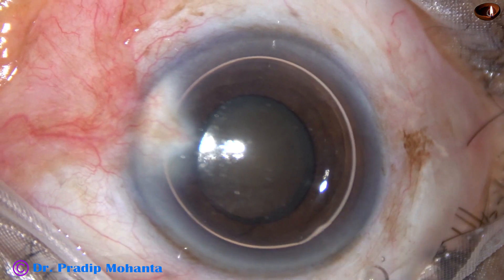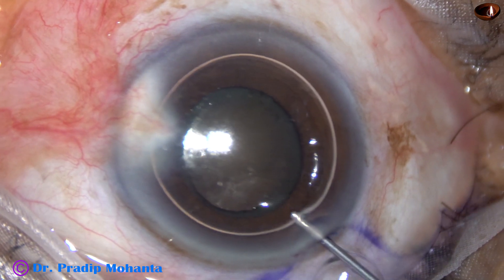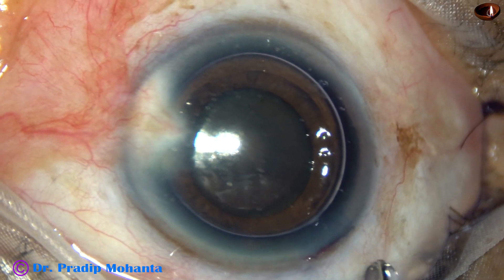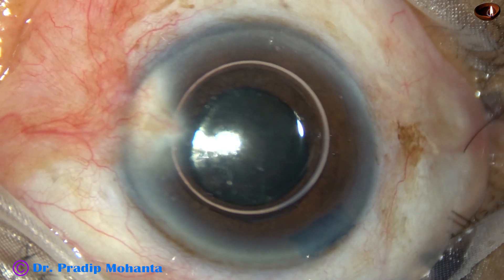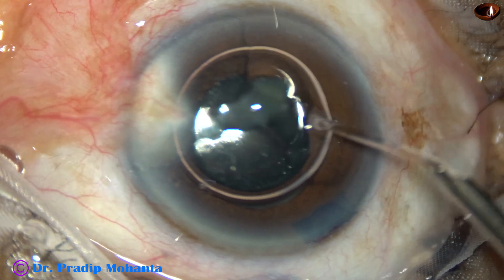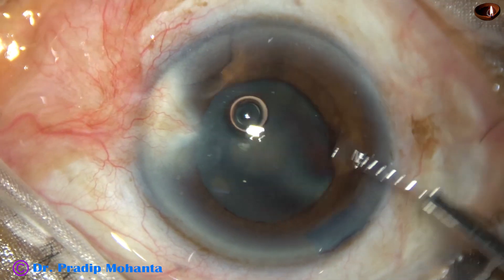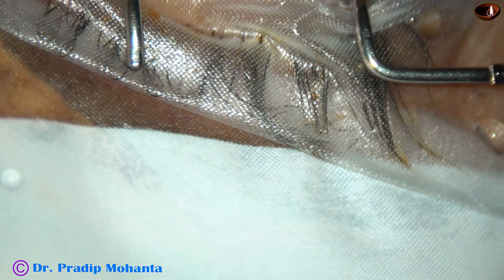An air bubble is injected into the anterior chamber, and then trypan blue dye is applied over the anterior capsule. A little bit of adrenaline is administered into the anterior chamber to see if the pupil dilates a little more. But in this case, the pupil did not dilate with application of adrenaline. So this is a 5 mm rigid pupil.